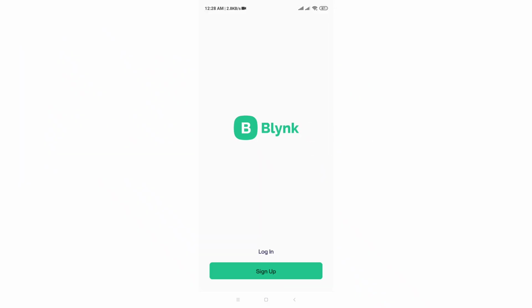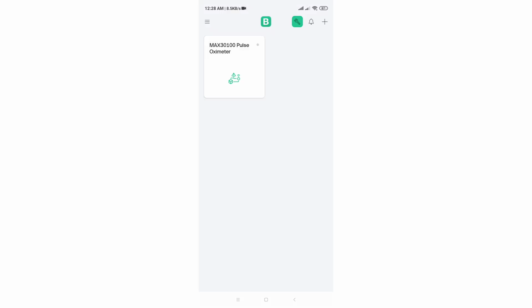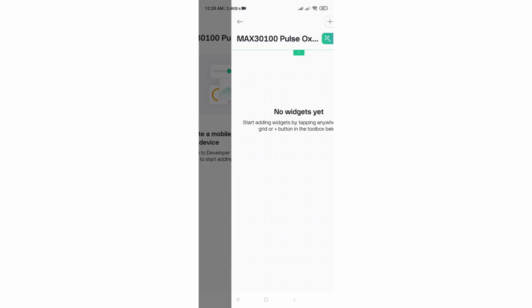Finally, let's set up the Blynk mobile dashboard. Download the Blynk app from the Play Store, log in, and follow the steps I show to mirror the dashboard on your phone.